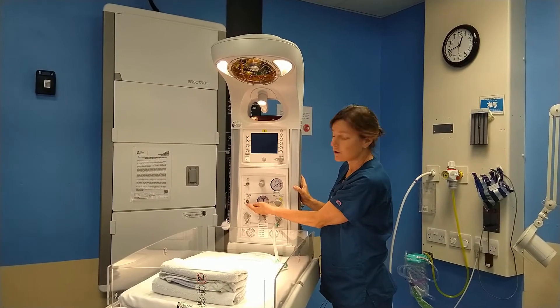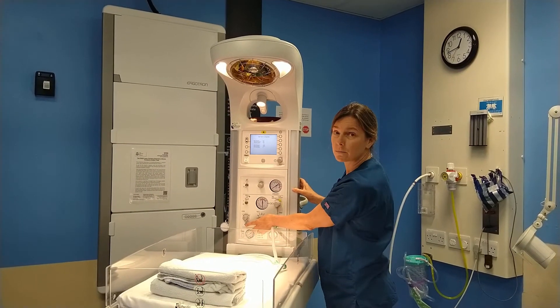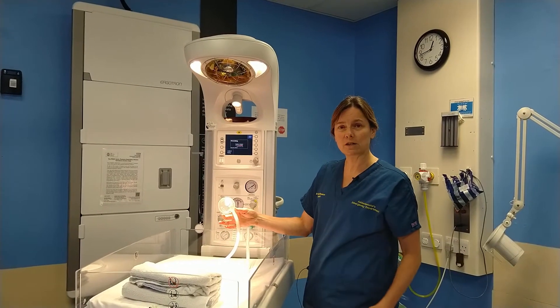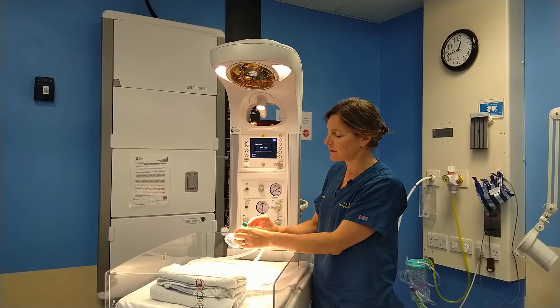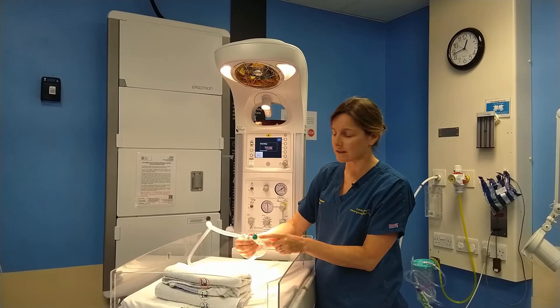Switch on the oxygen. Once oxygen is on it can either be delivered by this simple oxygen port here, or this one which is connected to ventilation tubing. This is a simple mechanical ventilator — you use a handheld mechanical ventilator which allows you to deliver PEEP. The PEEP valve is on the top of the mask.